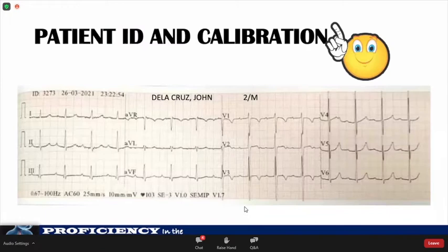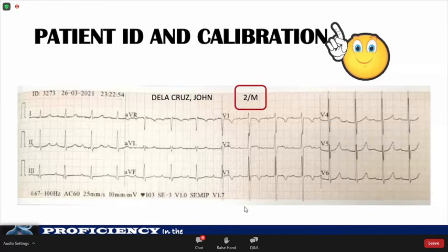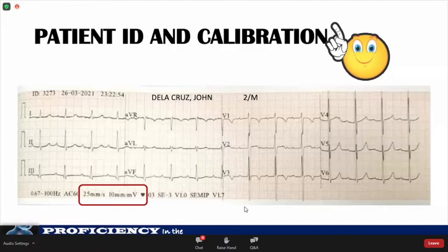First things first — check the name on the top of the ECG to make sure it is the correct patient. Then check the age of the patient, remembering that heart physiology and normal values vary with age in the pediatric population. Check the date and make sure this is the ECG you ordered — if there are old ECGs, it is always a good idea to compare. And lastly, check the speed and the calibration.